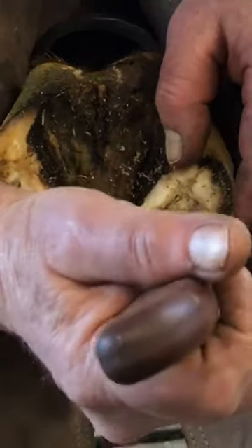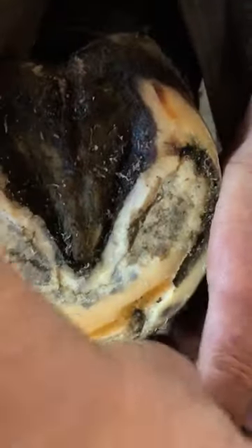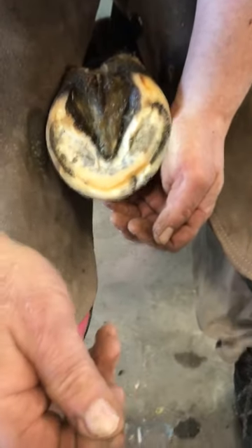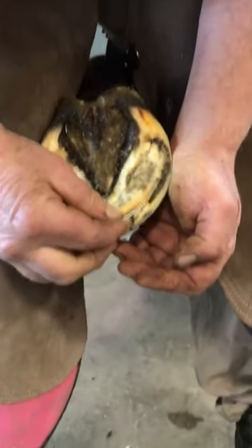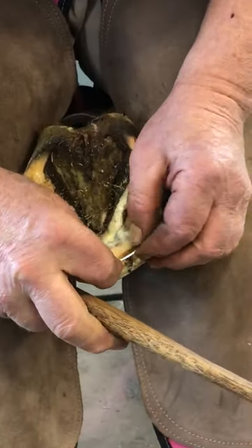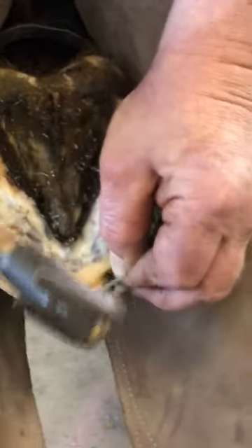They've made a little groove right here to accept the hoof tap. I take the hoof tap and position it — these little barbs on the end of it are curved with the direction of the white line — and I put this right across the area that I want to bridge.